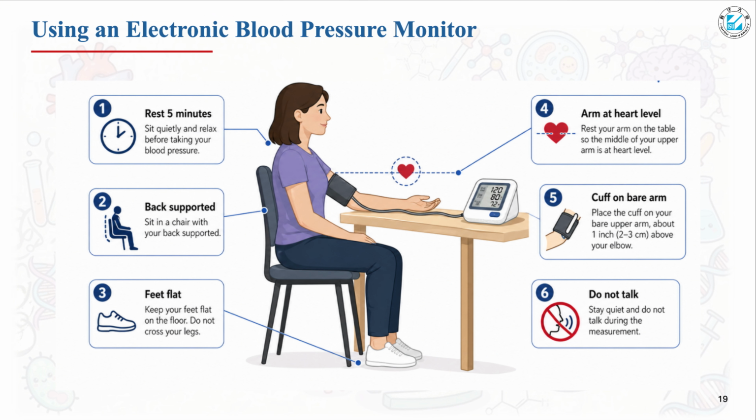Electronic blood pressure monitors are widely used in hospitals, clinics, and at home. They are convenient and easy to use. However, correct technique is still very important. Before measurement, the person should rest quietly. The correct posture during measurement follows the same principle as when using a mercury sphygmomanometer.